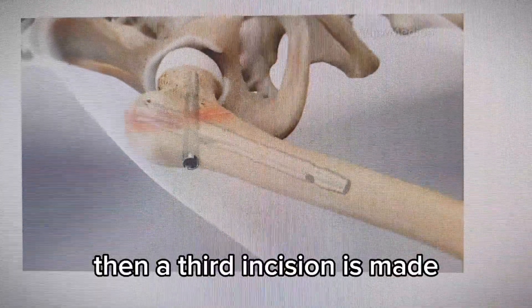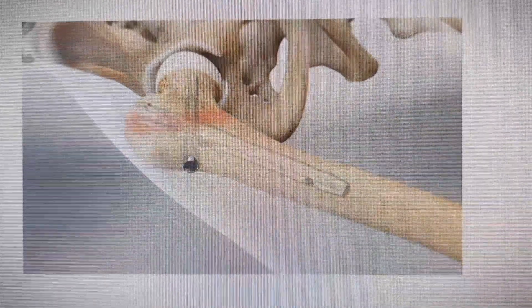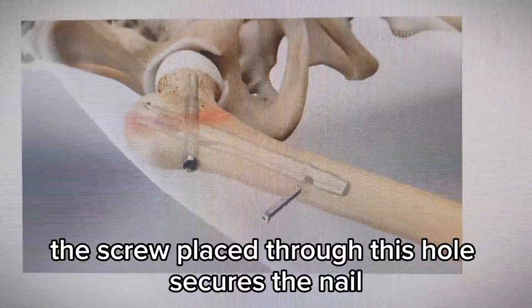Then, a third incision is made to reach a hole in the lower part of the nail. A screw placed through this hole secures the nail.